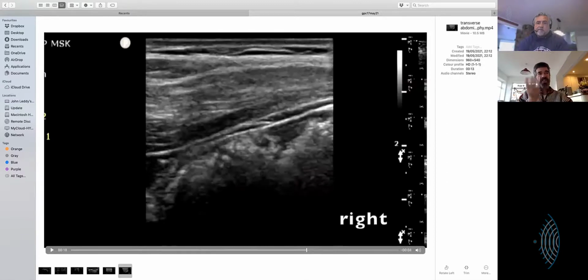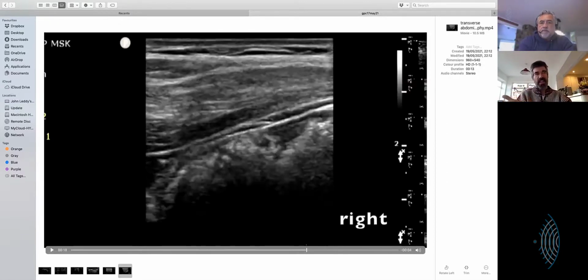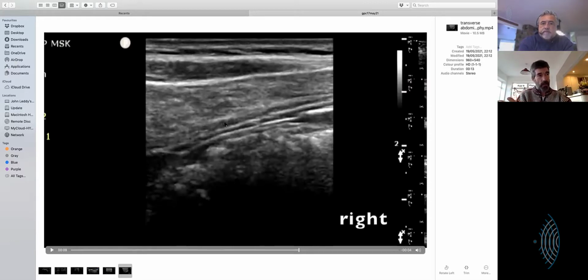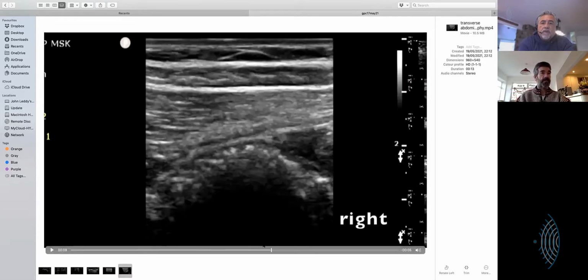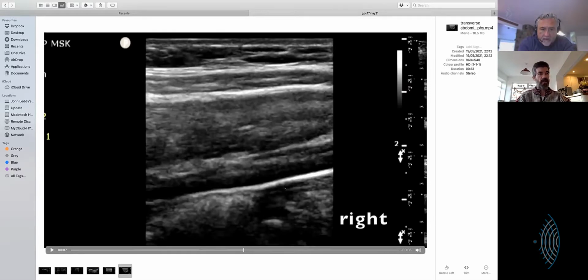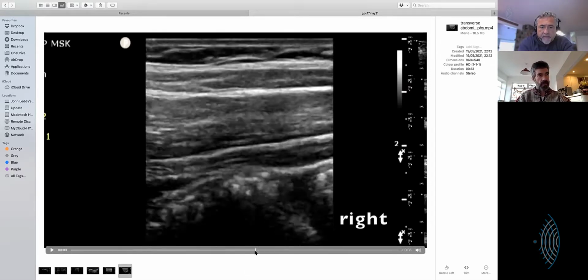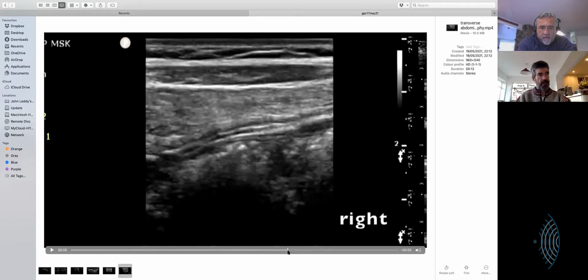Yeah, it is just atrophied away. It's got really, really thin. Wow. If you follow the boundary lines as you come through, you'll see they're still patent there.